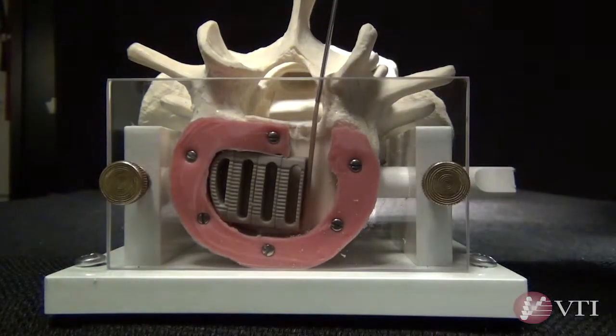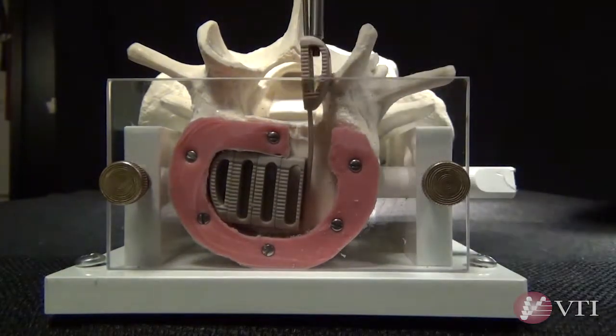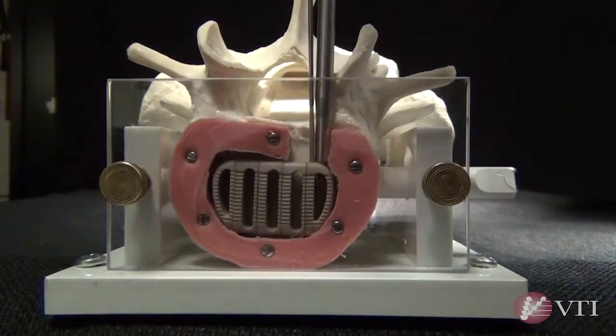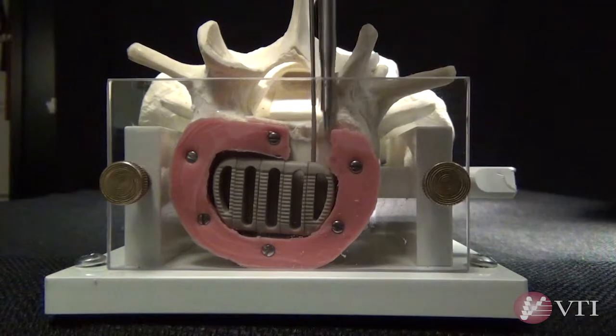Implantation of the interfuse device is complete when all desired segments have been interlocked, completely inserted, and all segment tails have been removed.